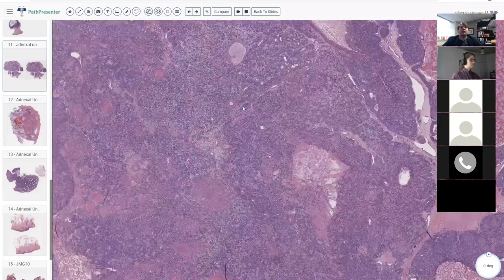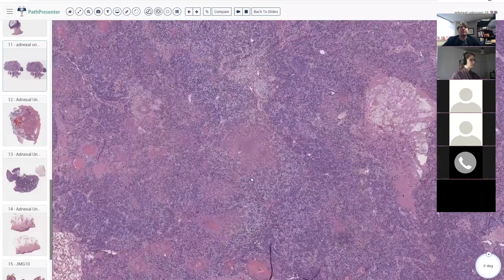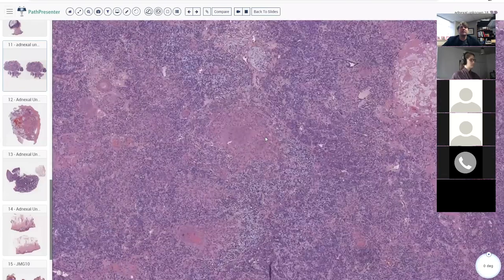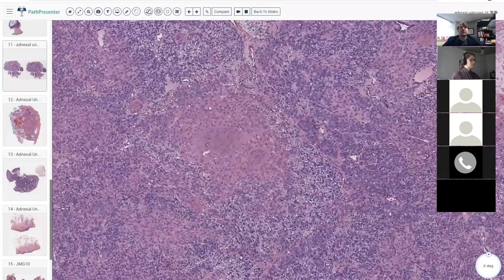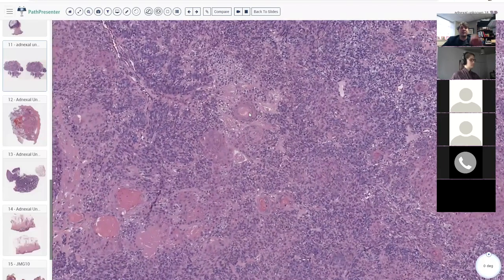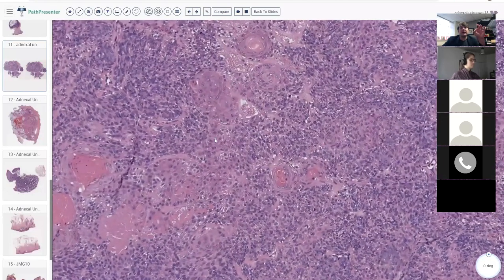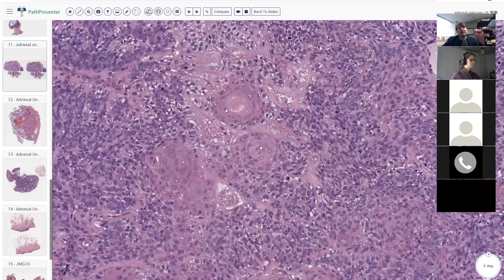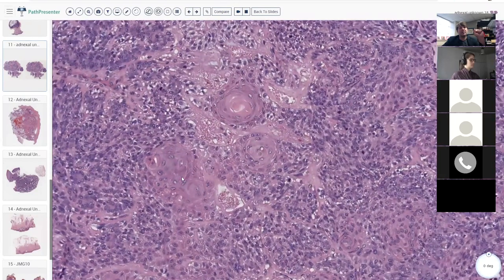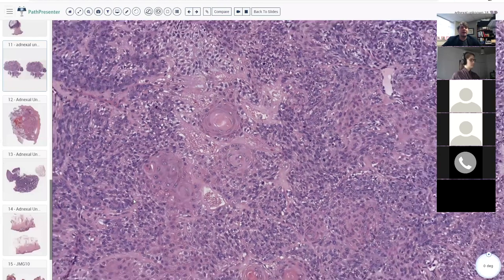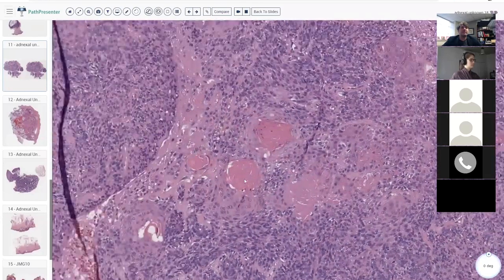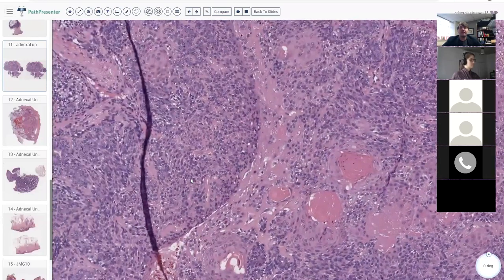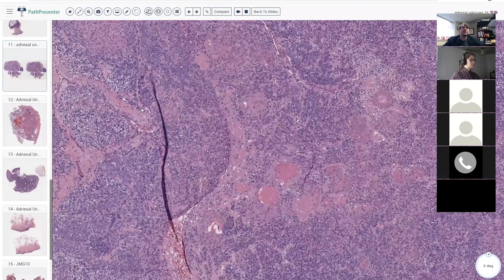I haven't given you any clinical information yet. Look at these squamoid islands, almost like squamoid morules — don't you get that in endometrial carcinoma? You get little swirls of keratinocytes sometimes. Anything else?